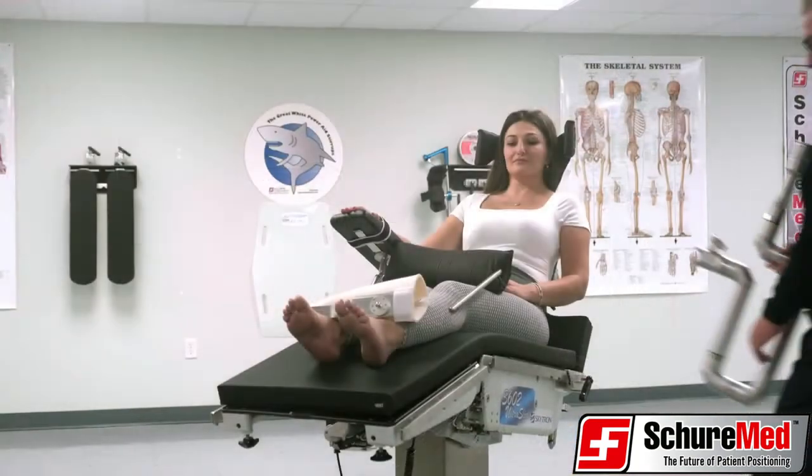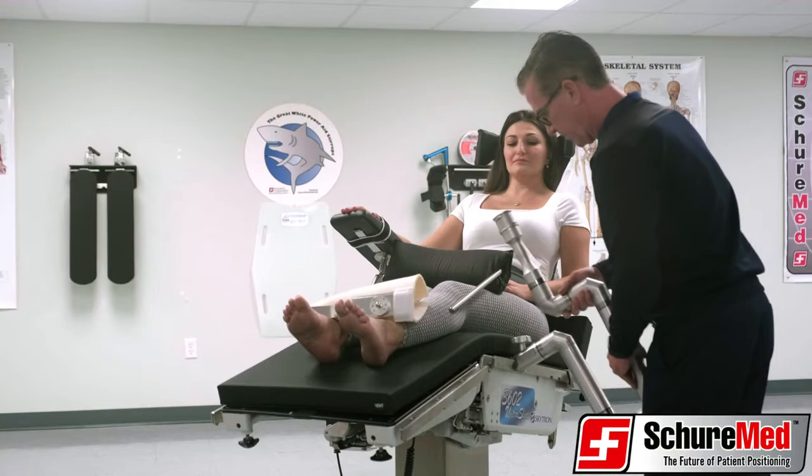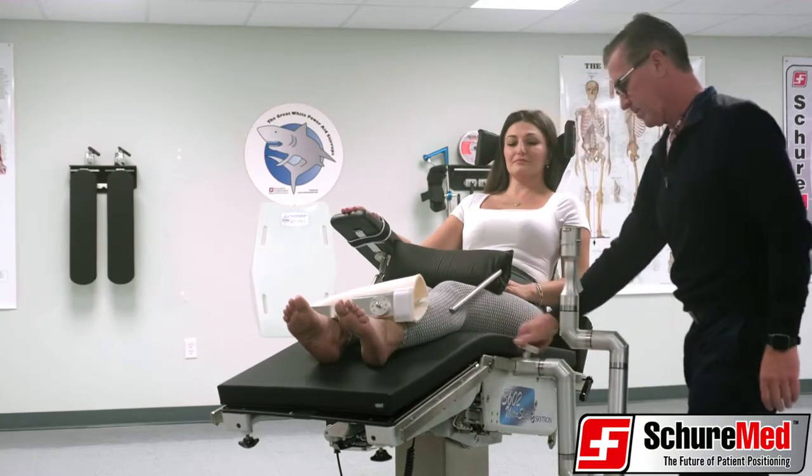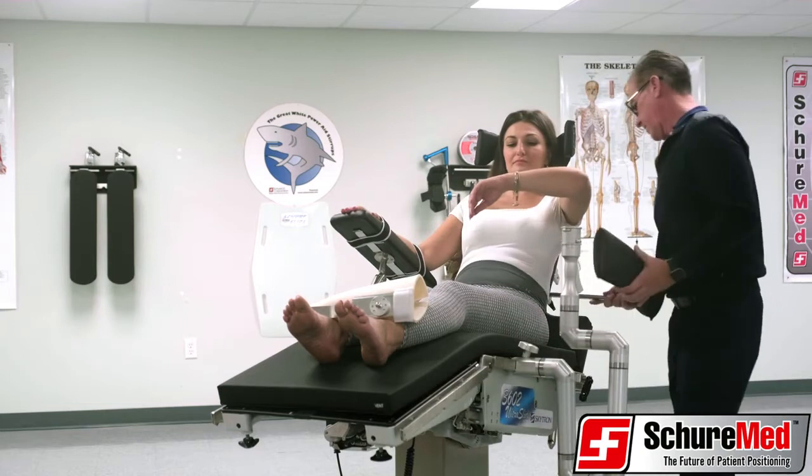The SureLock XPS easily attaches to any OR surgical table. Simply hook the table clamp to the OR tableside rail and secure by tightening the star knob to the rail.